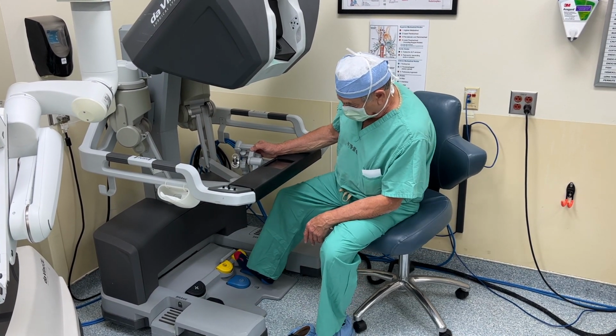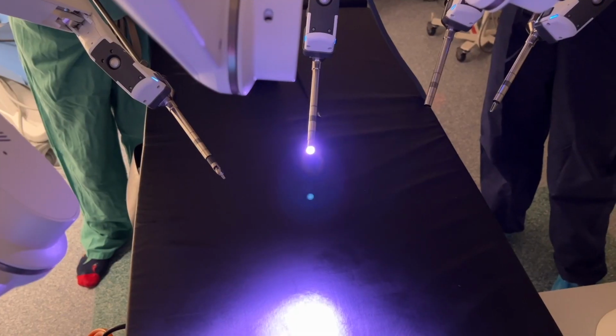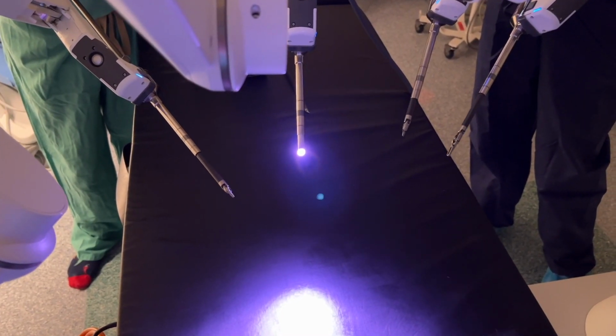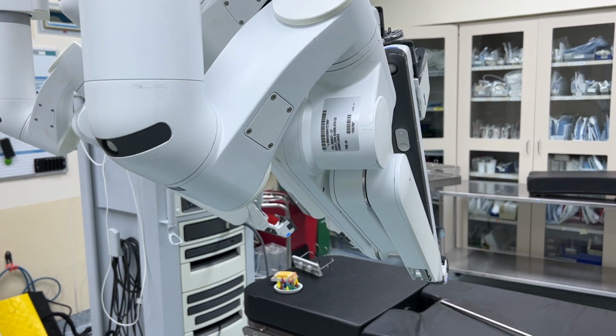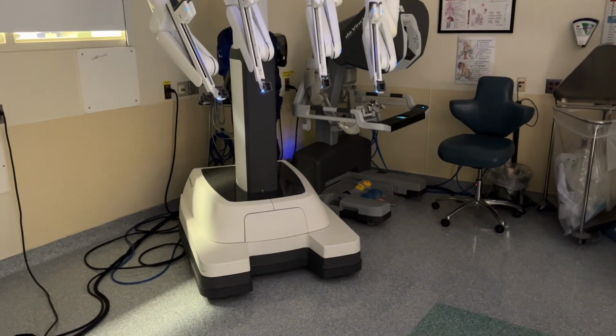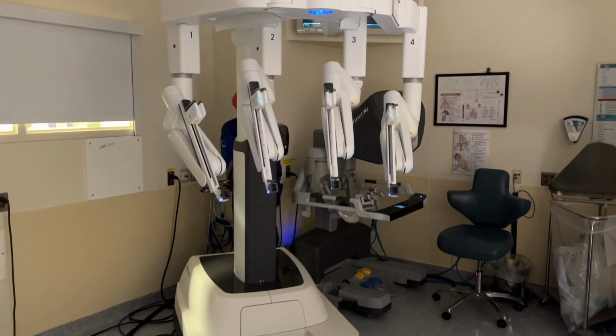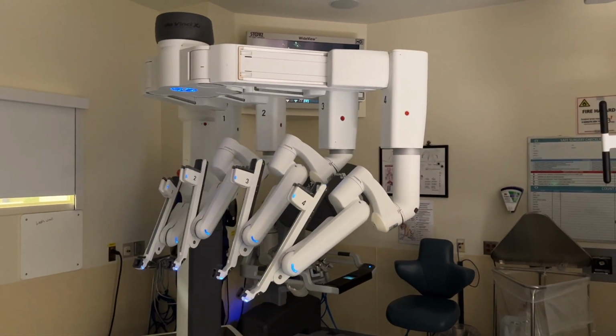Also, there's a side pedal that lets you switch arms from arm 3 to arm 4, or you can change the different arm configuration on the control panel, so that you can use 4 arms, and you can basically coordinate it back and forth however you need to hold something, and then to keep that arm still, and then to switch to a different arm.